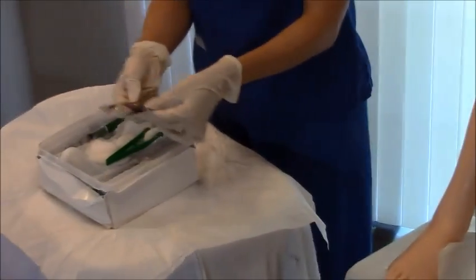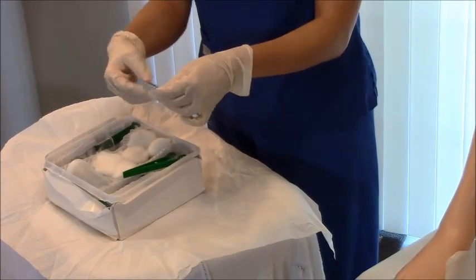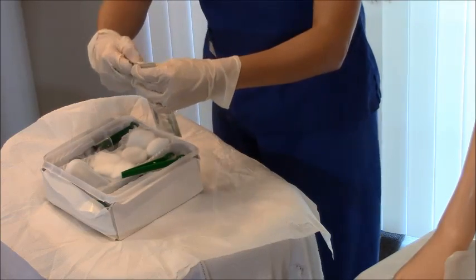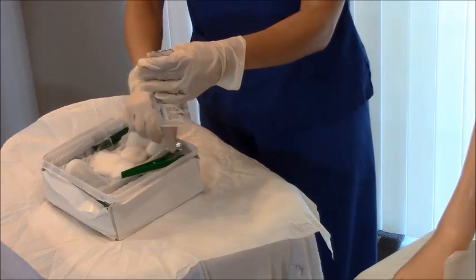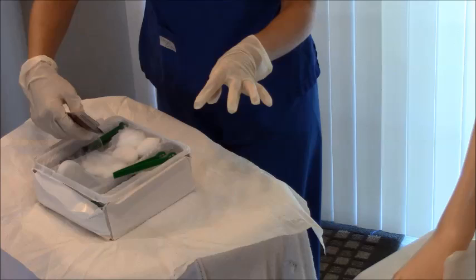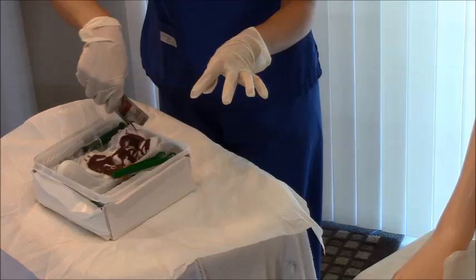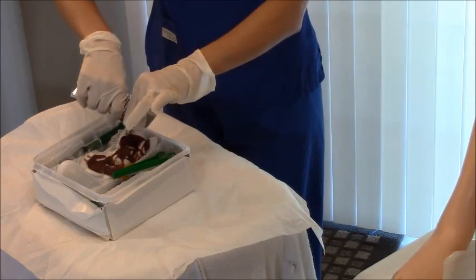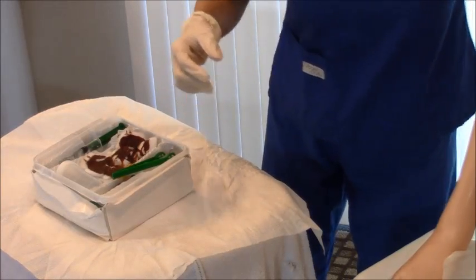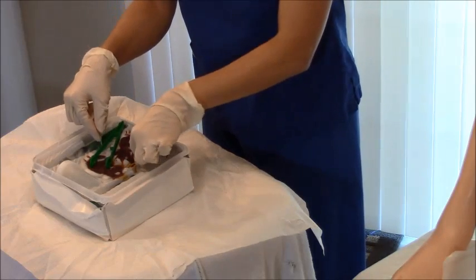Next, get your betadine and your tweezers. There's a little tear opening on the betadine packet — just tear it open and drizzle it onto the six cotton balls. Ms. Smith is not allergic to betadine, which is why I'm using it. After drizzling, toss the betadine packet in your trash and let the cotton balls sit so they're well saturated.